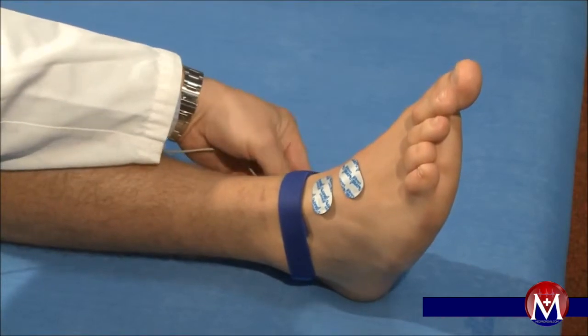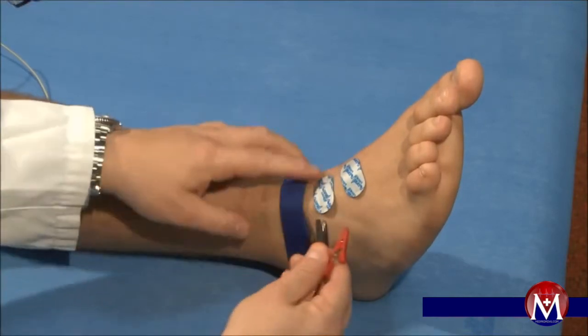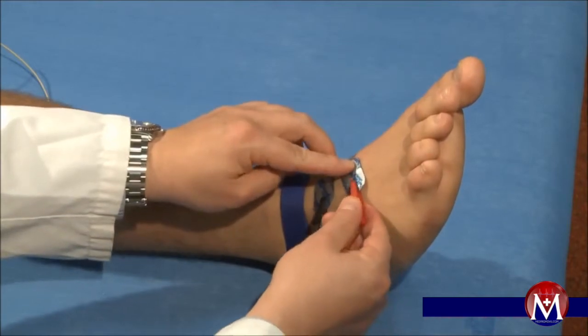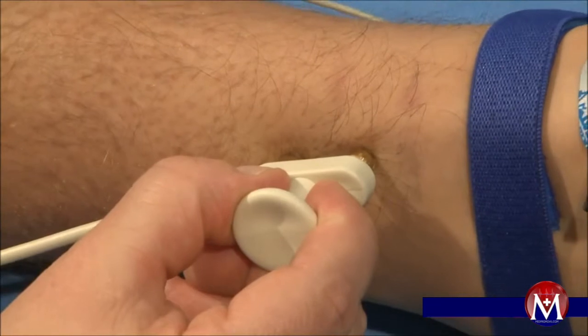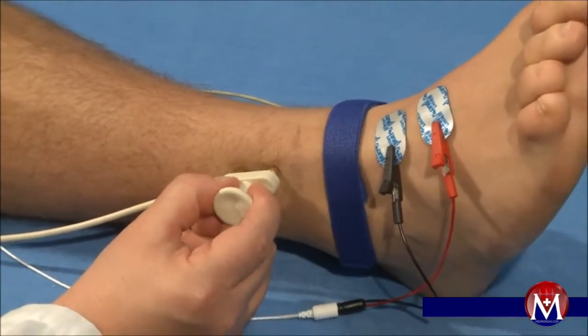The recording takes place on the central dorsum of the foot between the first and the second toe. The ground electrode is attached between the stimulation and recording electrode. It is stimulated 12 cm above the ankle joint, just before the beginning of the fibularis longus.